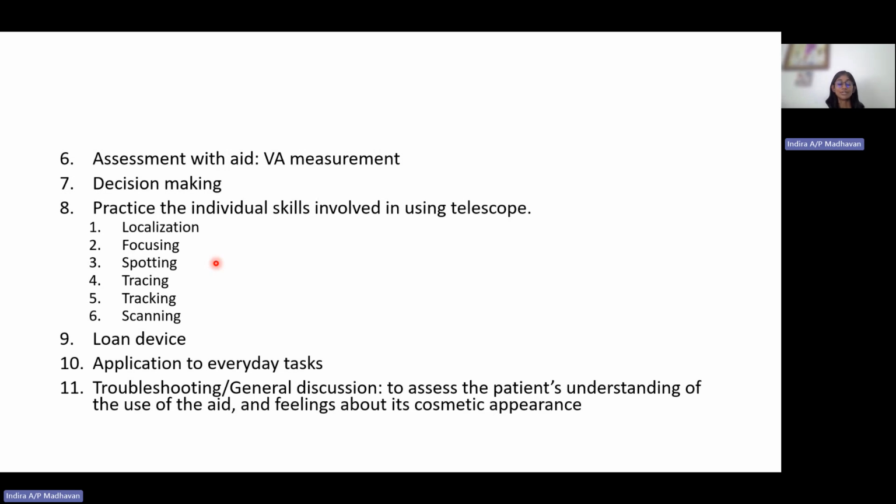Okay, so the answer for this is I'll go for the first one, the first magnification, with which the patient can achieve 6/18. Why? In low vision clinic, the better VA, the better the performance, that's not the concept of low vision clinic. In our low vision clinic, once they already achieve the target, then they're considered okay already, because the lower magnification will have a higher field of view. So the patient will be able to watch the television comfortably with that. So we select that one.